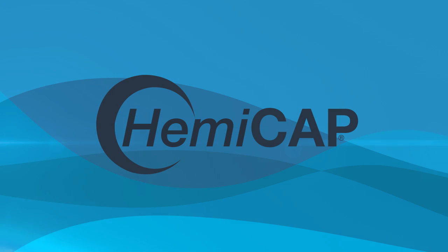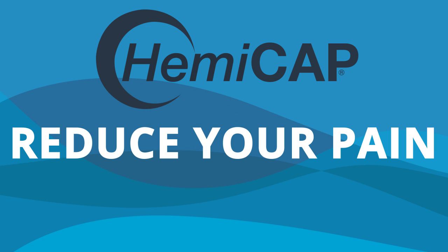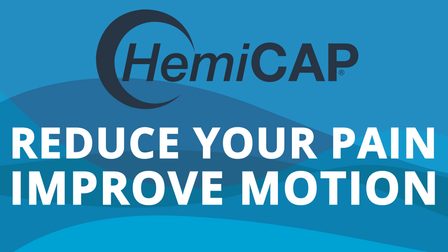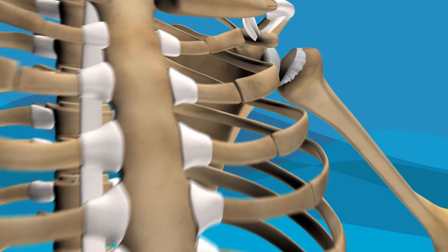The Arthrosurface Shoulder Hemicap Implant System is a simple procedure that can significantly reduce your pain, improve motion, and allow you to return to a more active lifestyle. Here's how it works.